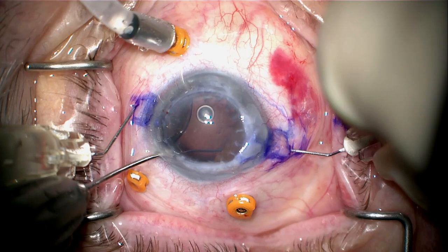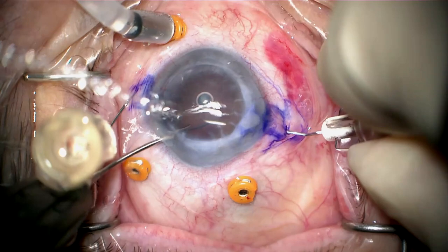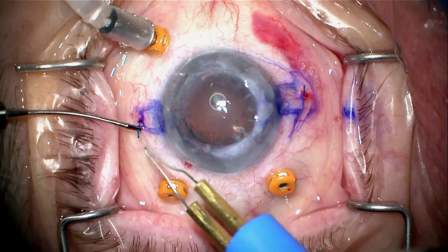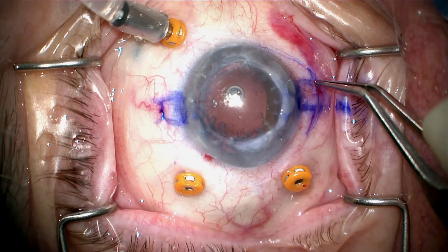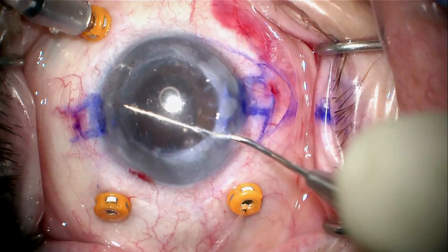Here I'm going to dock the first haptic into the 30-gauge TSK needle — this goes nicely. It's more difficult to dock the AR-40 haptics than the Zeiss CT Lucia haptics, but I've had good success with this lens to avoid the rotisserie phenomenon. I'm making my second needle pass with a pretty long scleral tunnel since I'll be taking the roof off this side. Docking my second haptic, feeding it in about 2–3 millimeters, then pulling both haptics out simultaneously. I now have a nicely centered lens. I'll melt the first haptic, then the second, creating a button-shaped melt by holding relatively close to the end of the haptic. The haptics are tight in these scleral tunnels — I push them all the way in so they're secure.